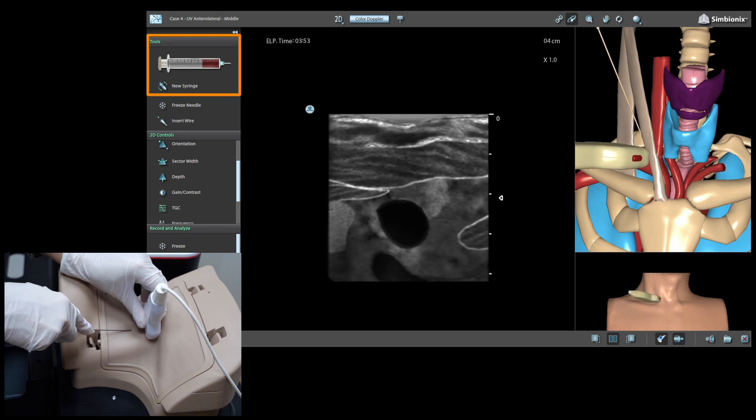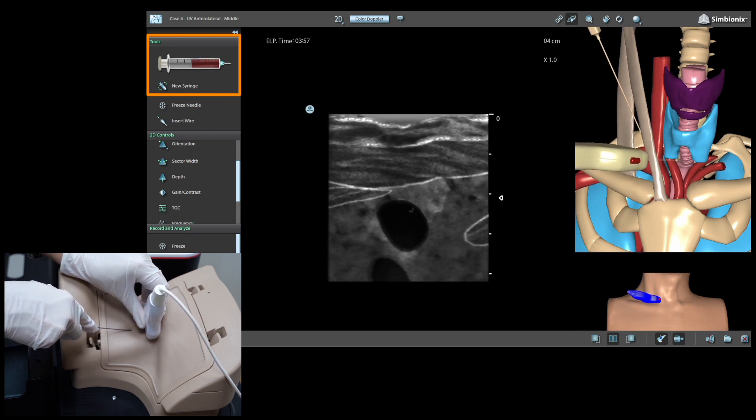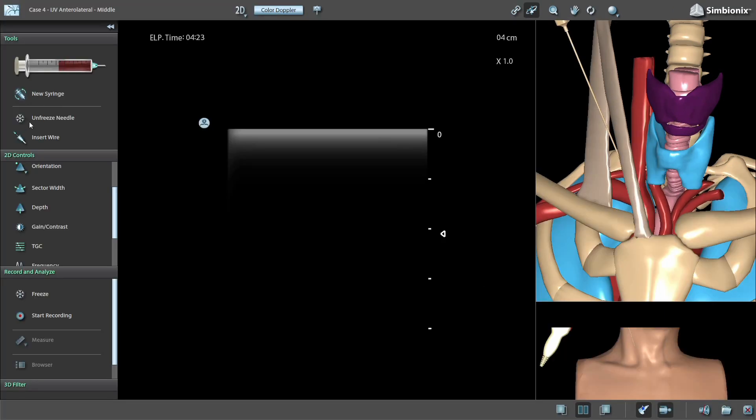While the needle is advancing, follow the tip with the ultrasound while tilting the probe. Once the vein is reached, the illustrated syringe will start filling with dark blood. Verify that the needle is in the vein, then place the probe down and press insert wire.